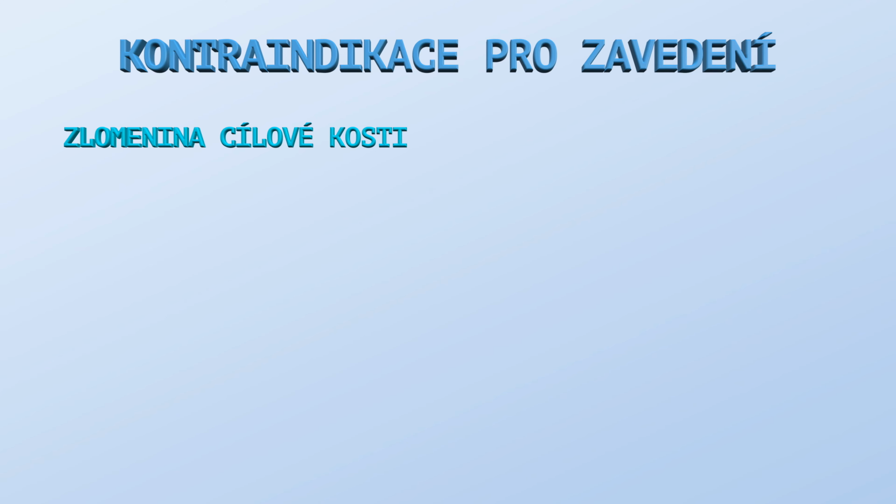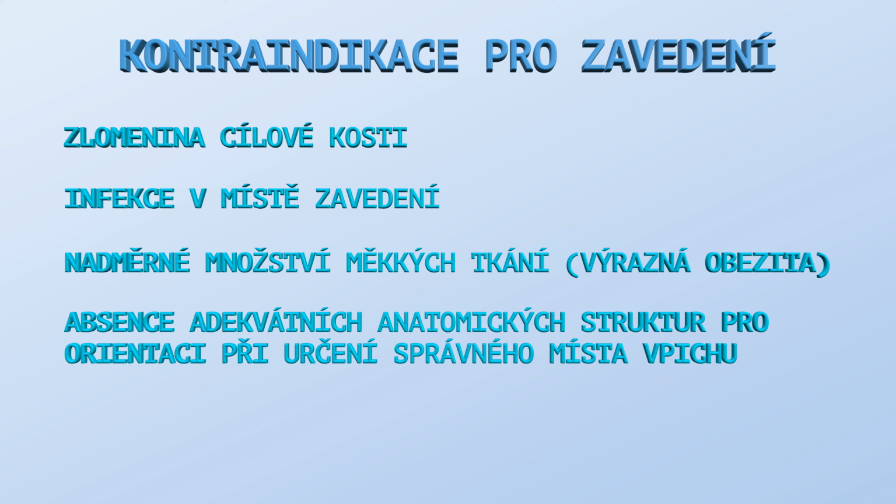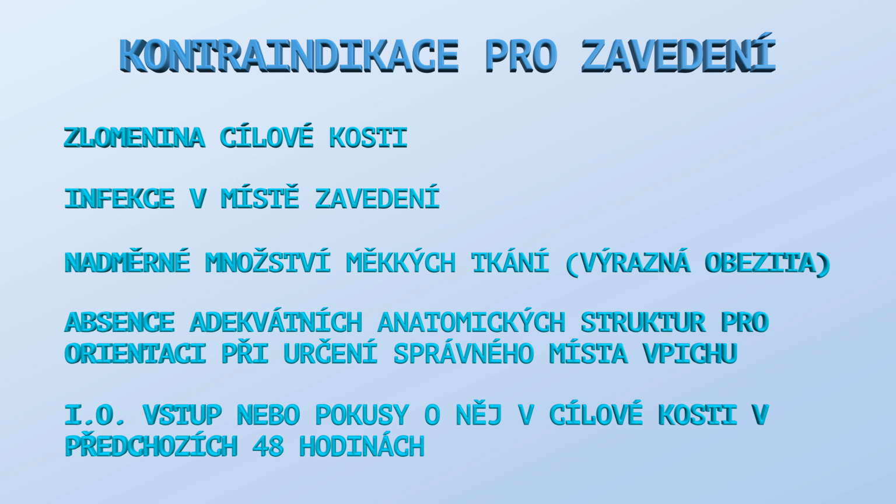Contraindications for intraosseous access include fracture of the target bone, infection at the insertion site, excessive soft tissue, severe obesity, or absence of adequate anatomical landmarks for identifying the correct insertion point. Previous intraosseous access attempts in the target bone within the last 48 hours, or major orthopedic surgeries, presence of a limb or joint prosthesis at the target site.